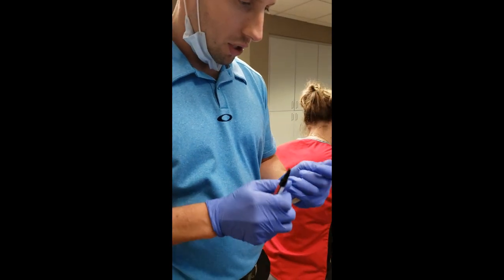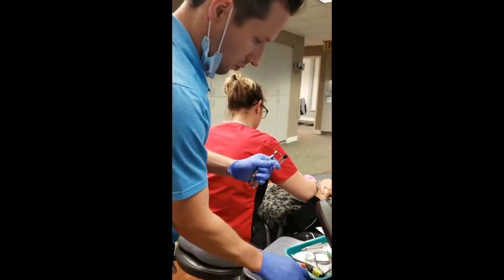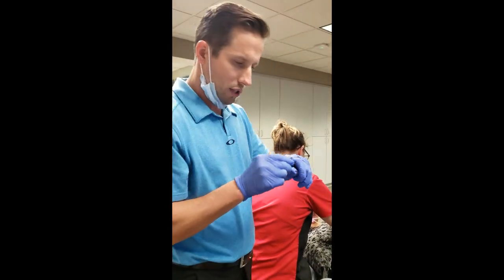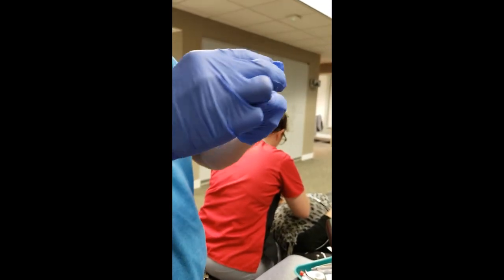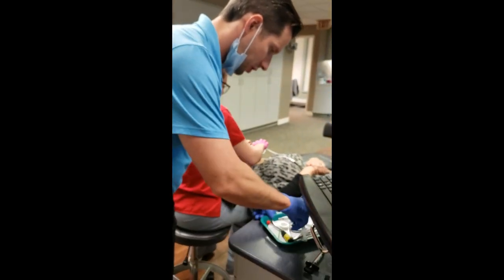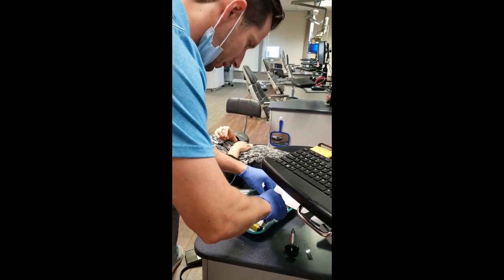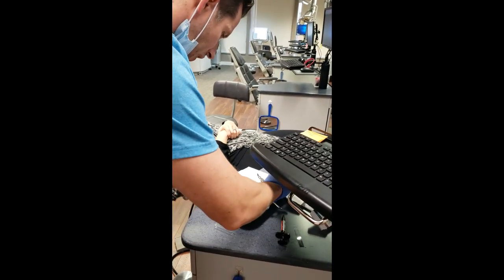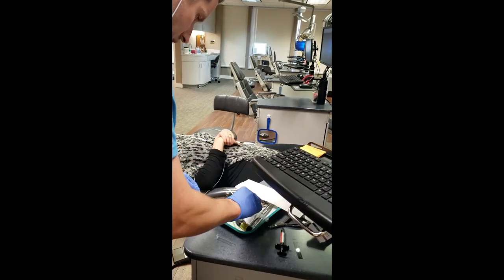What I'm doing is just loading the adhesives. They come like this - one will have a red cap and one will have a black cap. Red is for right. Another way you can tell is there are two dots on the right side as well. That is important - there is a way these are designed to go. You can see me loading that, and I place the red one under the light so I know which side is which.